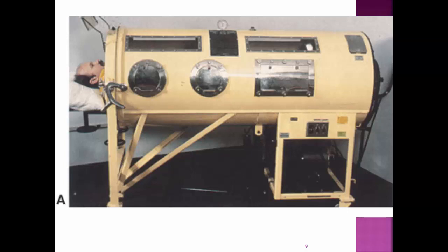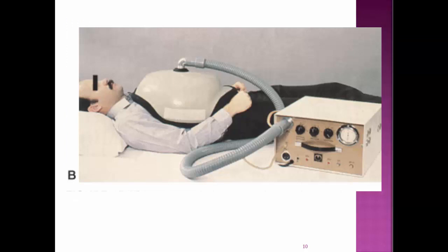Now, in the event of electrical failure, this thing has a hand rod right here that you can use to manually move this back and forth and at least keep the patient breathing until the power is turned back on. This is a chest cuirass. It looks kind of like a turtle shell. And when this is turned on, you notice it doesn't have any straps that go around the back, because when it is turned on, it sucks onto the chest and it stays there.